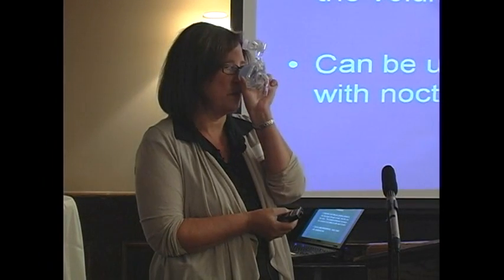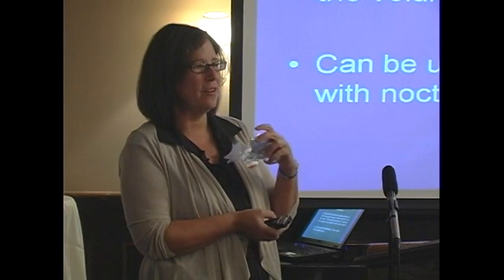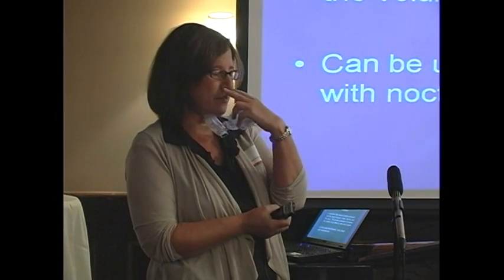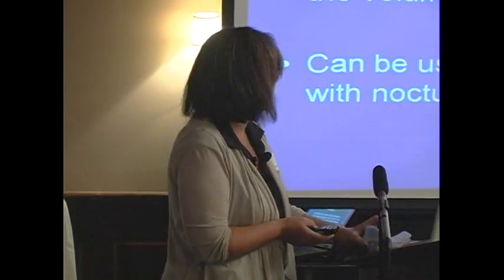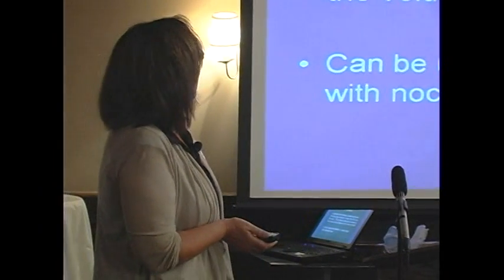This one would just fit over the nose. Sometimes they fit over the nose and the mouth, and then there's something called nasal pillows, which just goes up into the nose. And I think I had great pictures that didn't turn out. Thank you. Again, Steve Jobs.